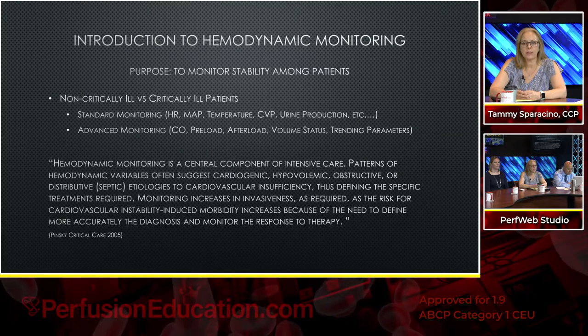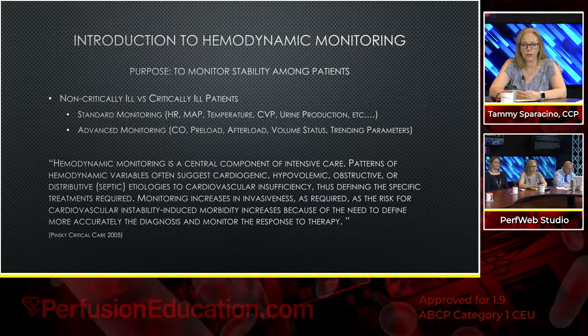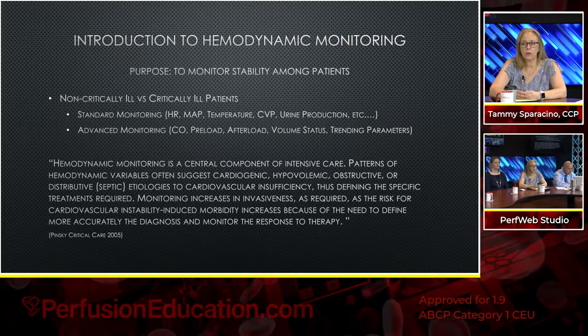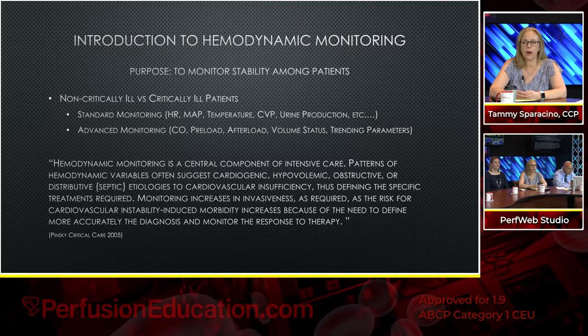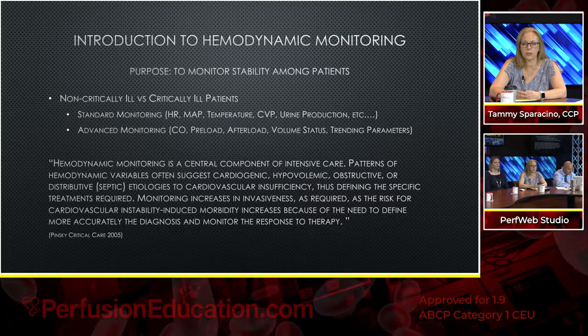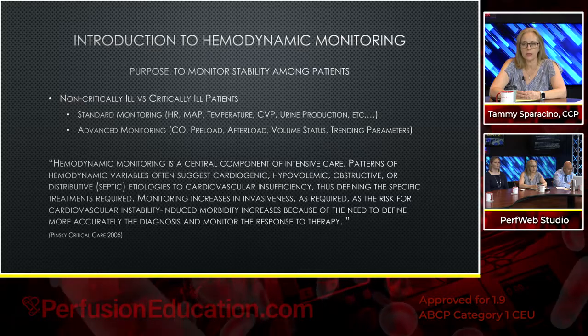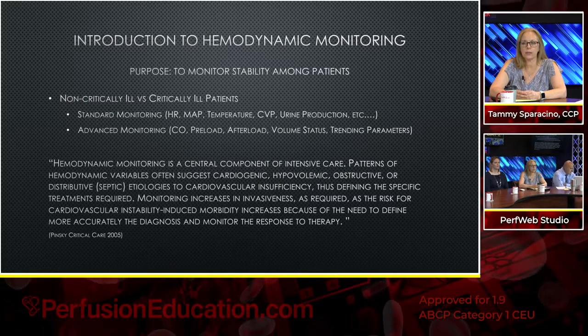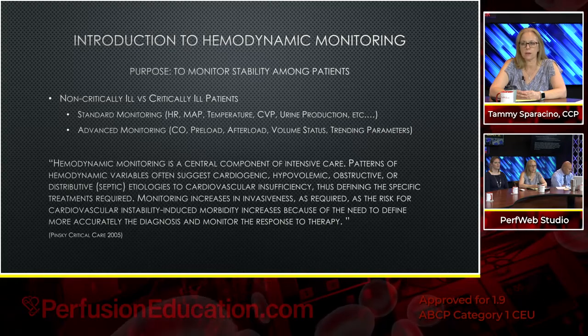Thus, it's defining the specific treatments required. Monitoring increases in invasiveness as required as the risk for cardiovascular instability-induced morbidity increases, because of the need to define more accurately the diagnosis and monitor the response to the therapy.